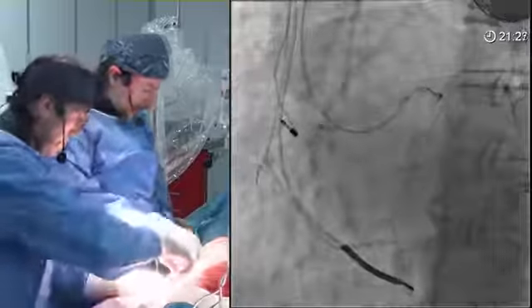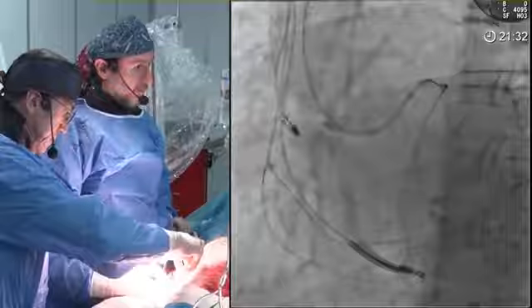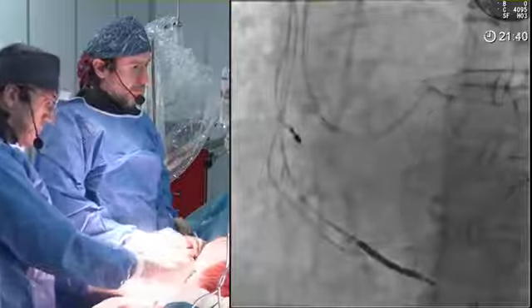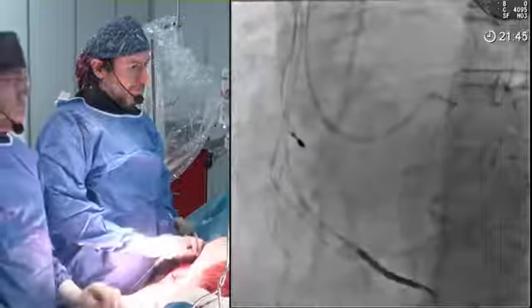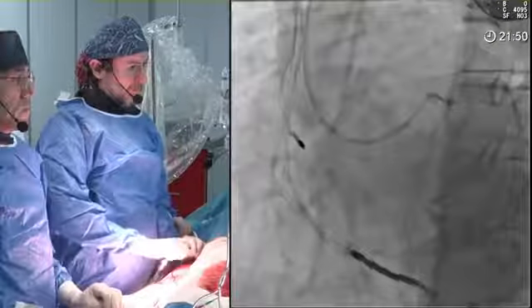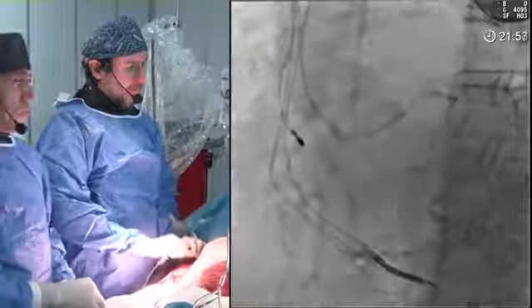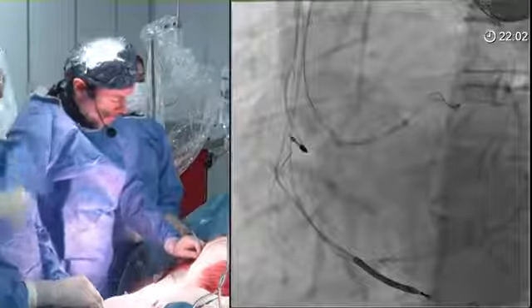I think, Baktash, a Judkins right guiding catheter would help more, because it could be easier to engage the ostium. We don't need any support, because obviously it will be difficult to puncture antegradely, but at least we have to make sure where the ostium of the RCA is, because we are blind here. Yeah, we have to have some targets somehow. Totally agree with you. I think CT angio is extremely important in this scenario, and at least we can see how much calcification we have, or if we have any calcification at the ostium. I think it would be a great help.